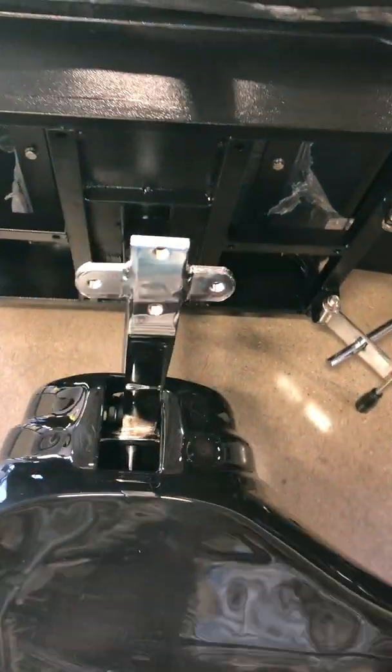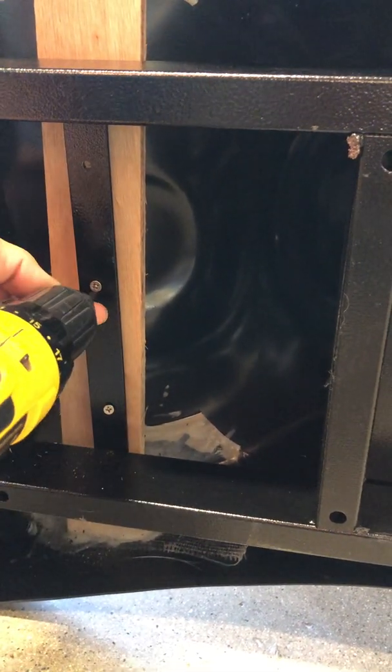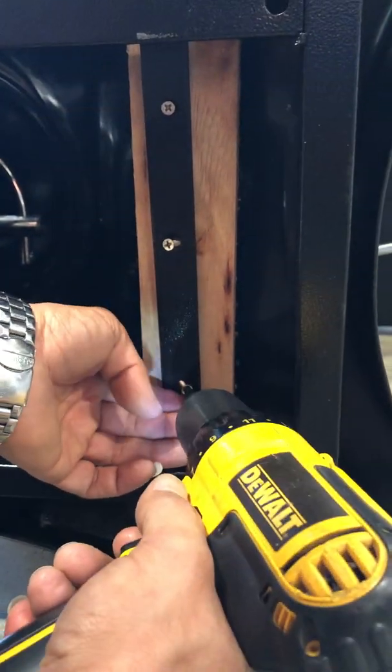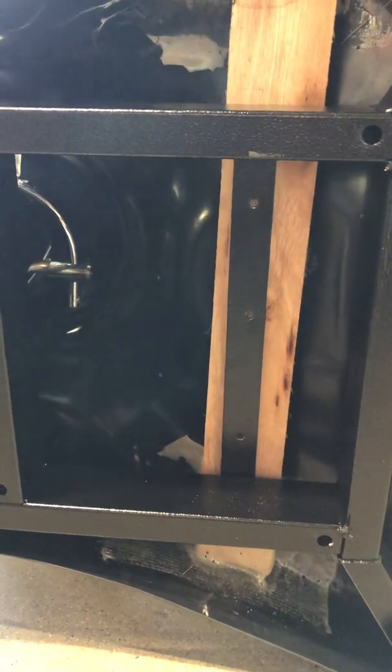All right, now we have completely taken apart the plastic cover. Now we're gonna move down to the bottom of the bed. We're gonna have 3 screws on the left side and 3 screws on the right side, so we're gonna go ahead and open a total of six screws. After completely taking off all 6 screws, we're gonna move the base plastic cover up, so we can have easy access to get to the pedal.